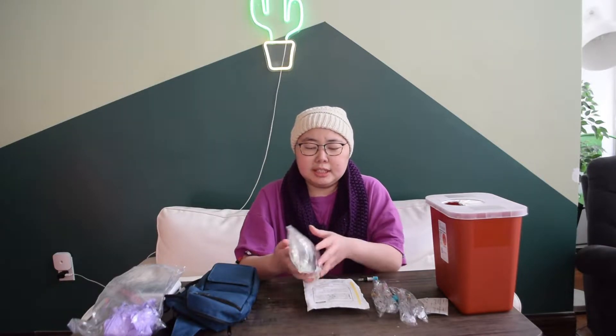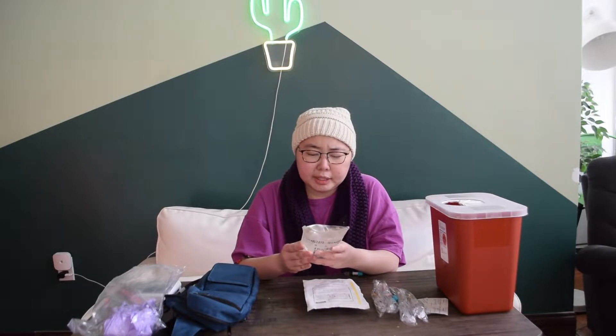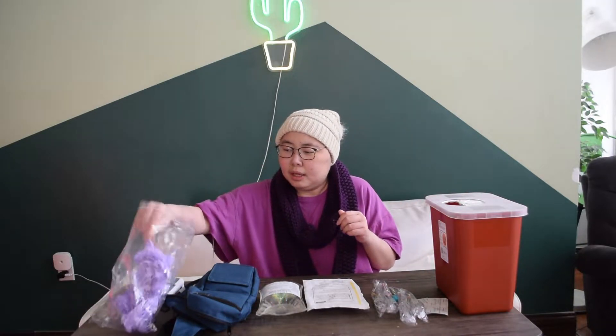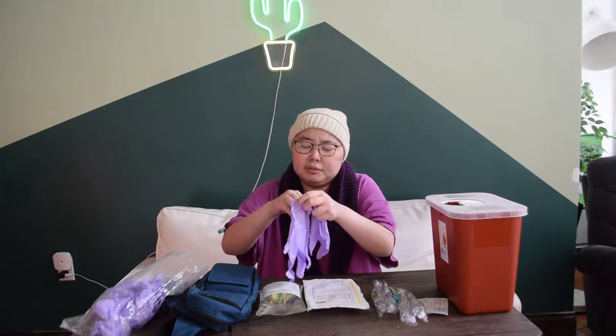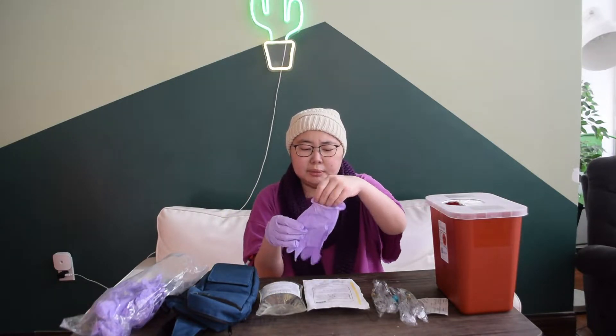So first, I took the magnesium out of the fridge two hours before using it so it's not too cold — it just helps it pump around better, and that's what was suggested. They always say to make sure you check the expiration date. It looks good and it has my name on it — great. So I'll go through all the supplies. I washed my hands already and put on some gloves. All of this is provided by the Penn Infusion Home Care Network — they deliver it in a box once a week with all the items you need.